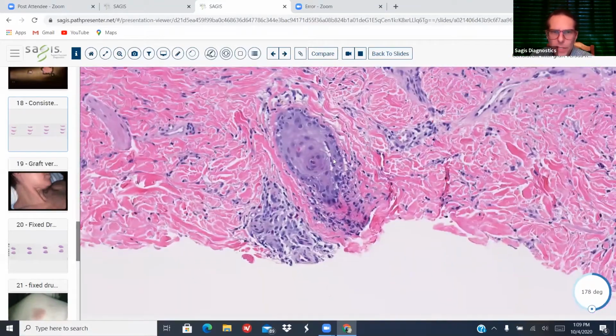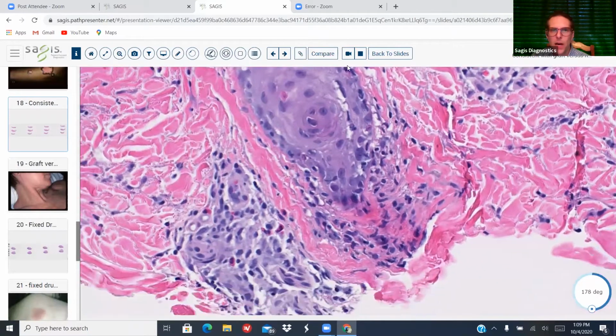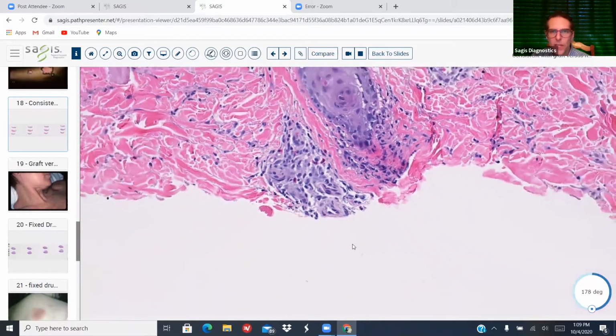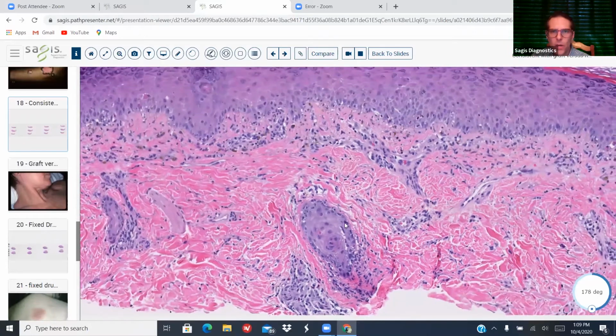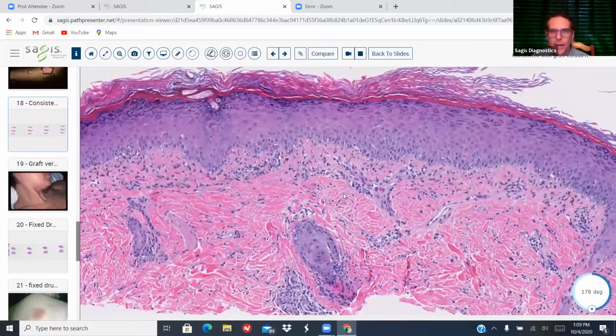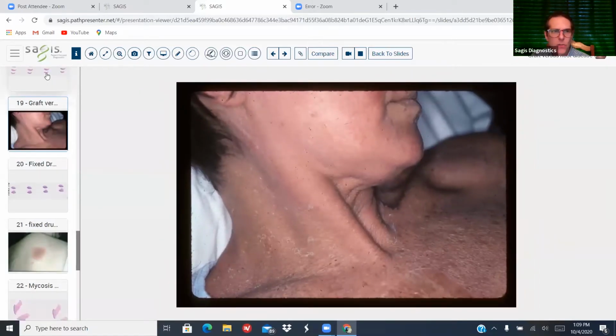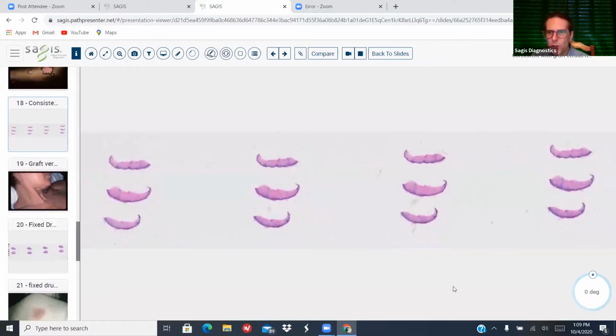One other thing to note is there's hair follicle involvement, and that can be seen often, like in planopilaris. And look, there are eosinophils, and that's going to be an important point with this. So this patient is in a hematology ward, so again, clinical history is vital, because with the interface dermatitis and eos, this could just be a lichenoid drug eruption. However, we have hair follicle involvement, and this is what the clinical presentation is of the patient. So this is graft versus host disease.